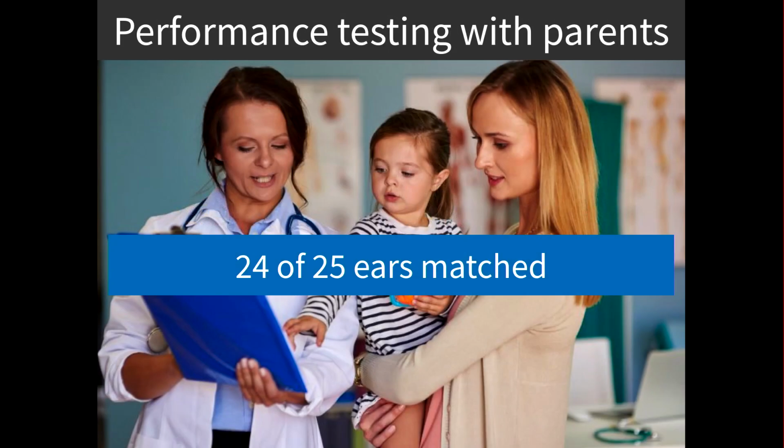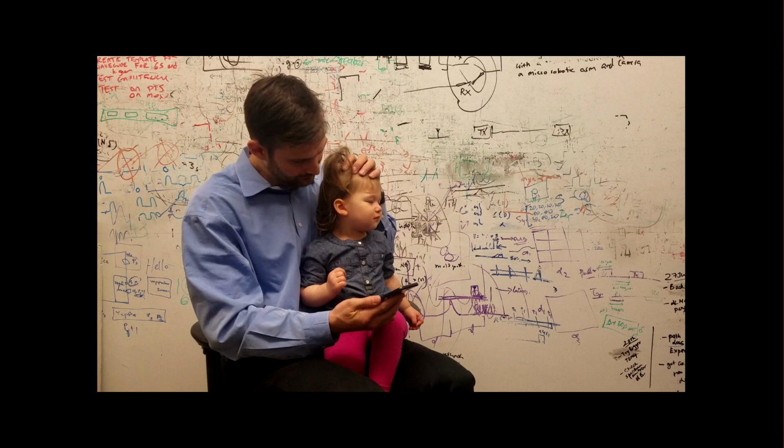Finally, we ran a user study where we got parents. We asked them to take a couple of minutes just to learn how to use our app in the pre-op area and test it on their own kid. We then had a trained doctor test the app on the same ear and found that in 24 of 25 of the ears, the results agreed with each other. So I'm going to close now with a fun little video showing how you might test this on your own kid.